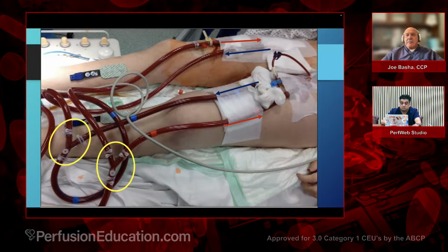Now, let me show you this. We talked about how the cannulas are placed. It's nerve, artery, vein. The vein is always going to be medial, and the artery is going to be lateral, and the same thing on the other side. So this cannula is flowing this way, and it's connected with this Y connector, and if I follow it up, it's coming to right here.